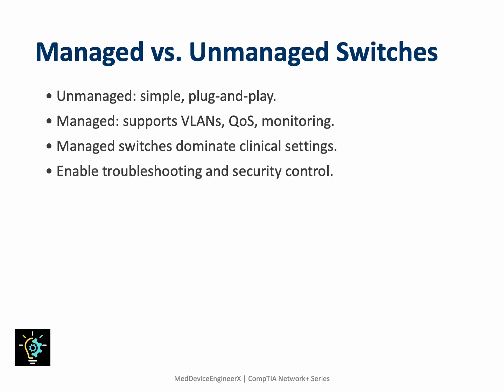Managed switches are preferred in hospitals because they allow network monitoring, VLAN setup, and diagnostic tools. Technicians can access switch interfaces to verify port configurations or apply firmware updates. Unmanaged switches, while easier, lack control, and are not ideal for environments where uptime and traceability are essential.